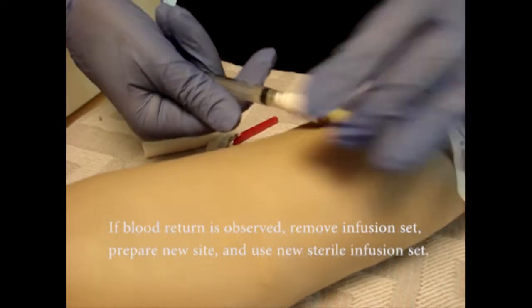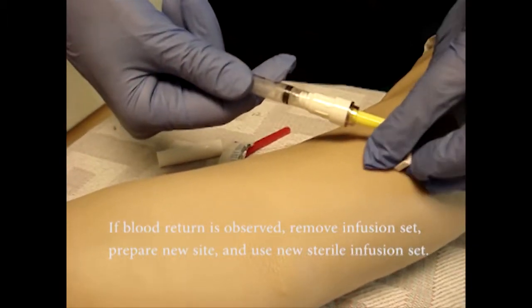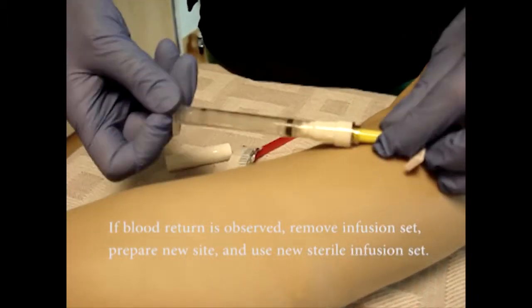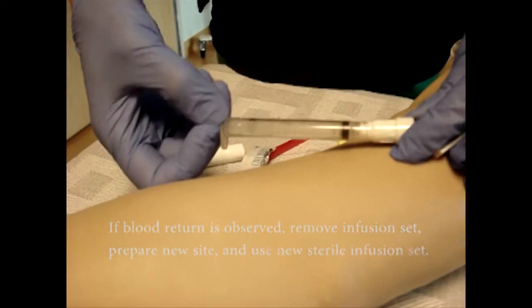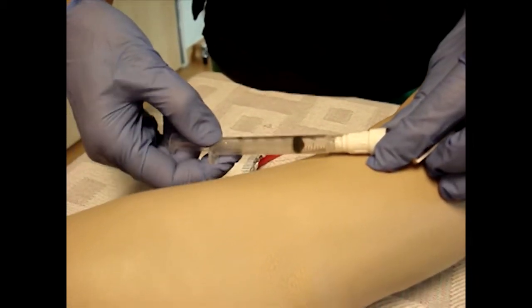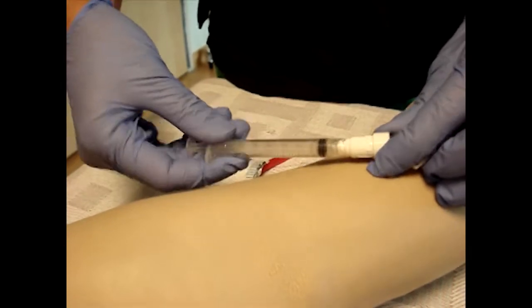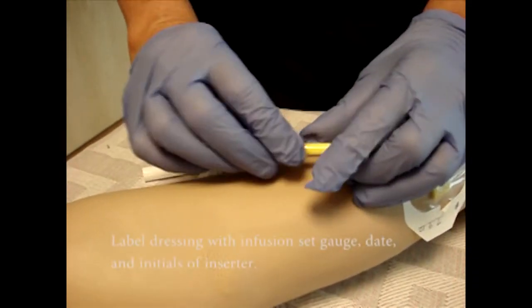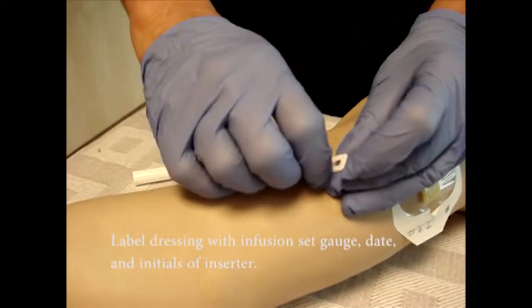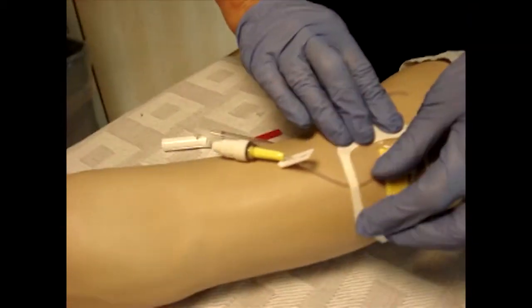If blood return is observed, remove the infusion set, prepare a new site, and use a new sterile infusion set. Label the dressing with the infusion set gauge, date, and initials of the inserter.